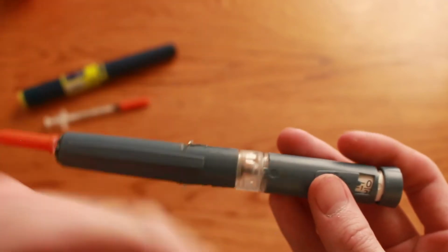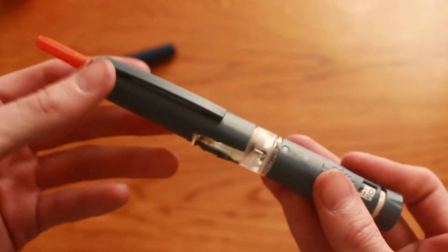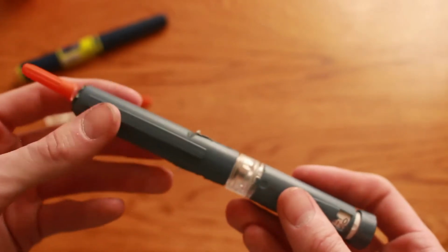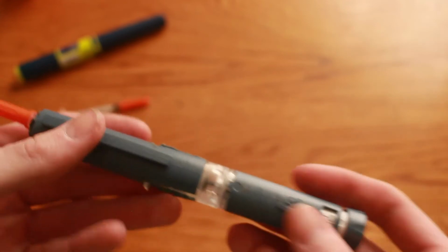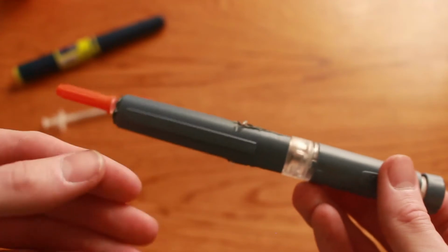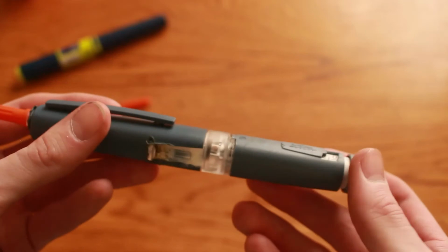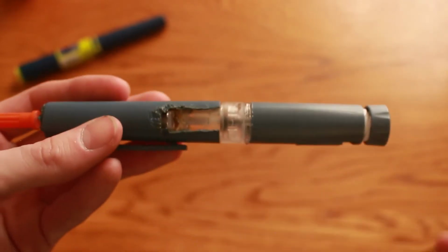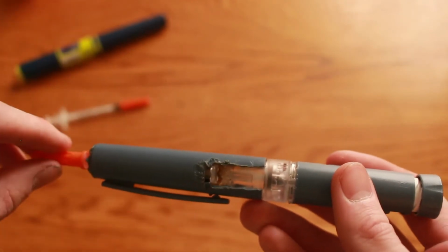Because one, the plunger here is not pushed back when there's force applied to it. For example, other pens, such as the refillable pens, if you push them back a little bit, they will give and push back. That won't work for syringes, because syringes have a little bit more oomph to them. You need to push them a little bit harder than the pen fills. When I tried it with a refillable pen, it just didn't push it down. But with Lilly's, the plunger doesn't push back, it only pushes forward, and it actually does push the syringe plunger through just fine.